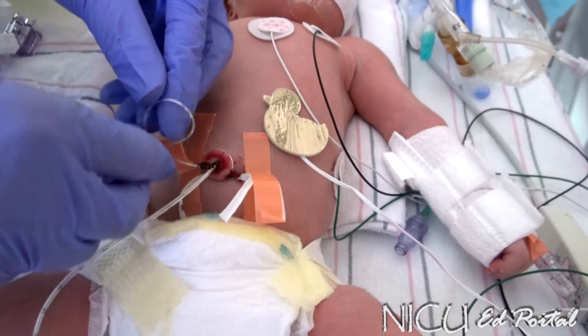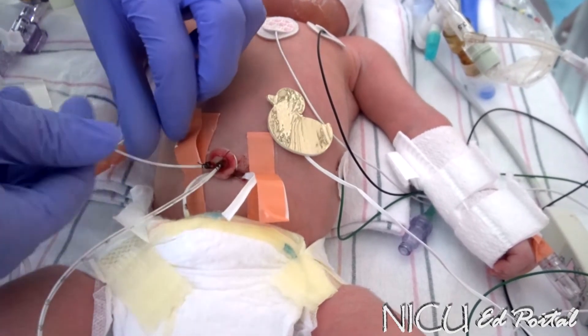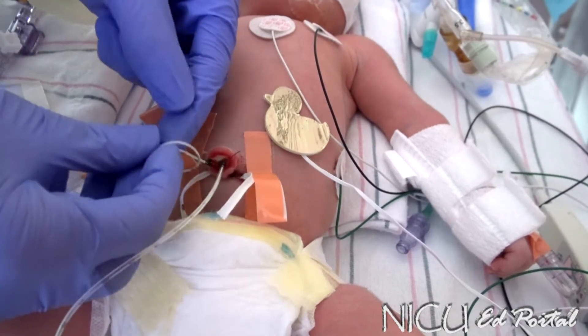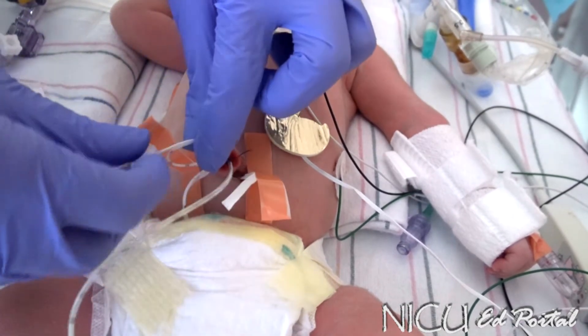And that way we can always see the markings. So we will give a little loop.